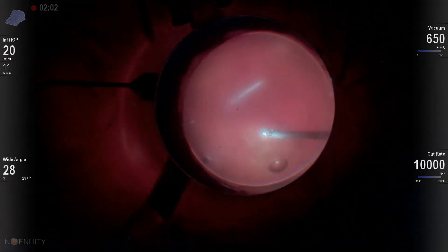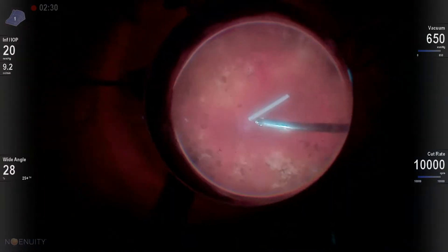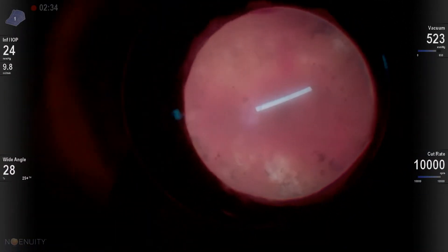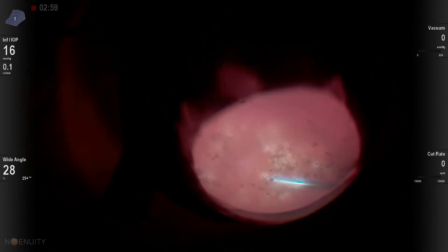This is just a really quick video of a diabetic patient who had received an Ozurdex injection and then developed a vitreous hemorrhage. Whether the vitreous hemorrhage was related to his diabetic retinopathy or somehow related to the Ozurdex injection is unknown.